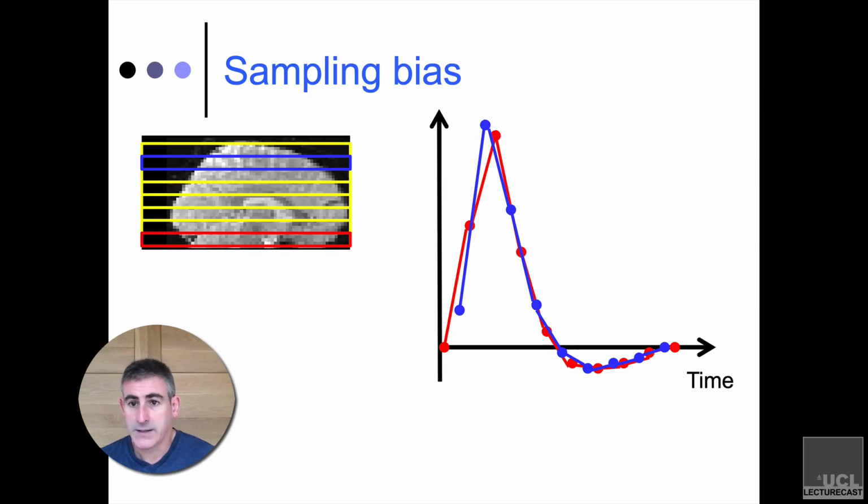They're not wildly different, but given that the effect sizes that we're measuring are small to begin with, anything that biases you for or against measuring it accurately is something that we need to avoid. And that's the problem with slice timing, and that's what people are talking about in terms of using a slice timing correction. Can we come up with a reference volume that we're going to say is the neutral point and adjust everything so that it acts like we acquired it all at that same point in time?